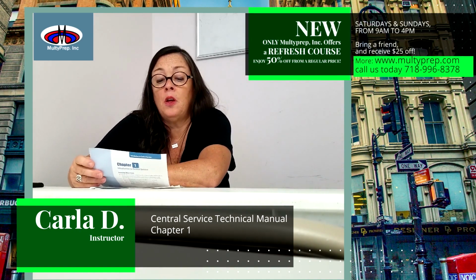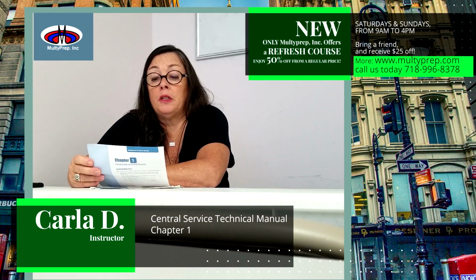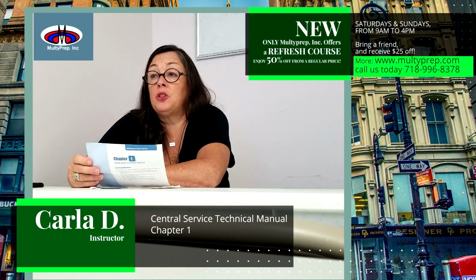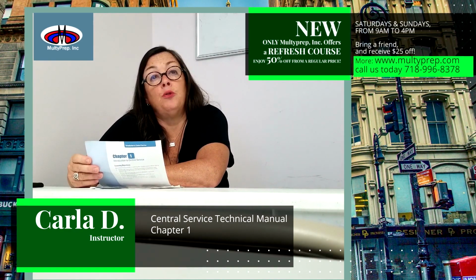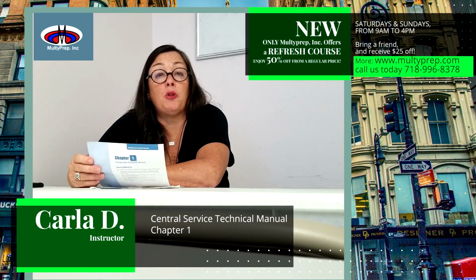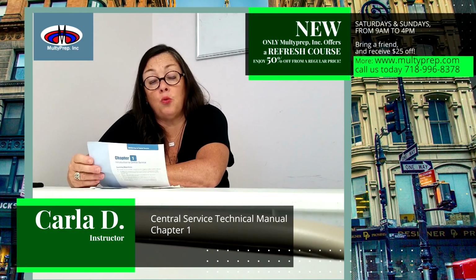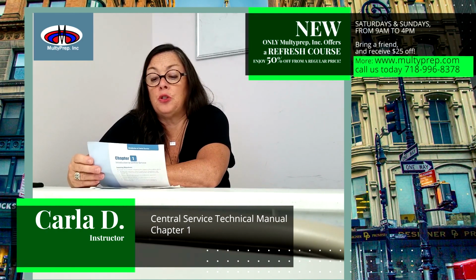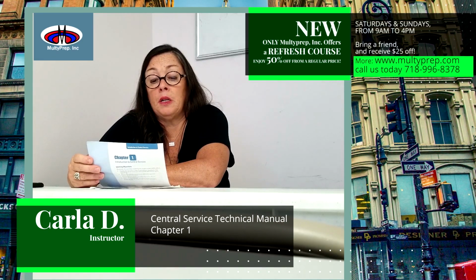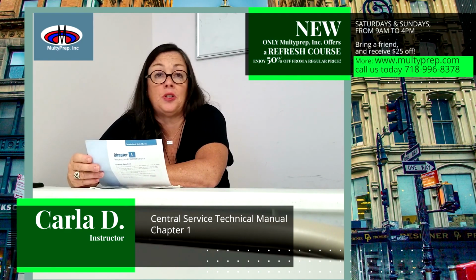Introduction. The majority of medical procedures require the use of supplies, instruments, and/or equipment. Some items are used once and then discarded, while others are reused multiple times. Reusable items must be thoroughly cleaned, inspected, disinfected, and/or sterilized before they can be used to treat other patients. The Central Service Department in a healthcare facility performs these major, important reprocessing activities.